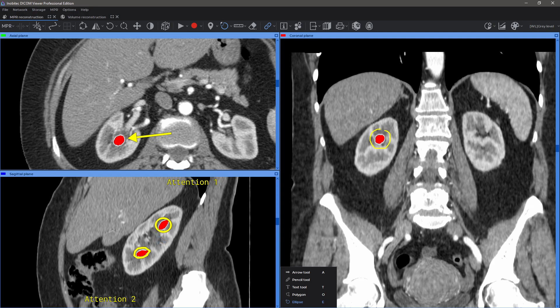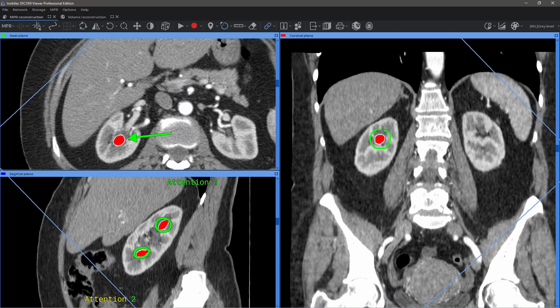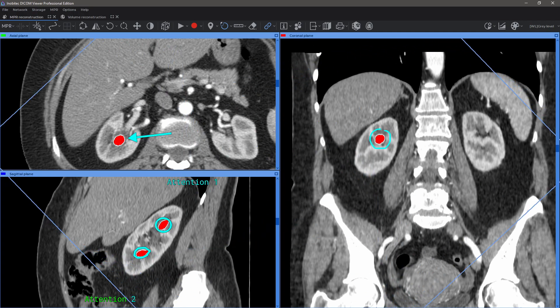For each type of annotation, you can separately set the name, color, line size, and font.